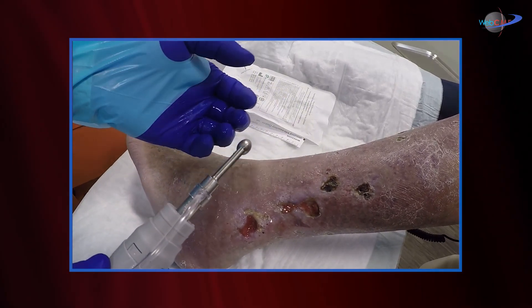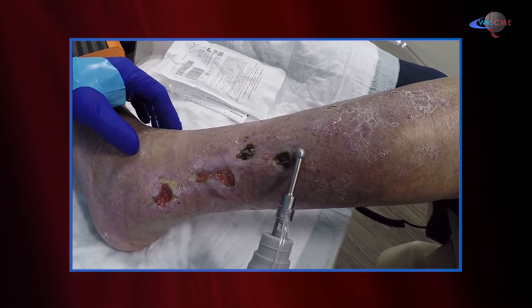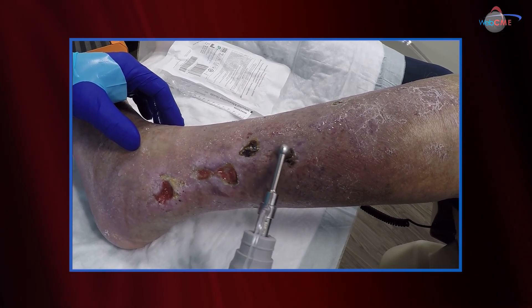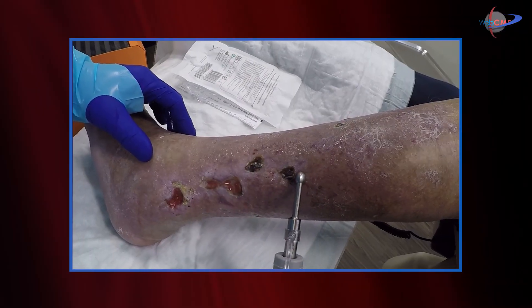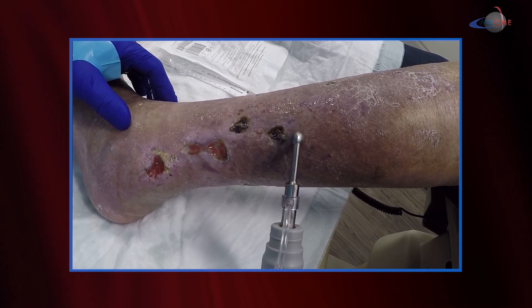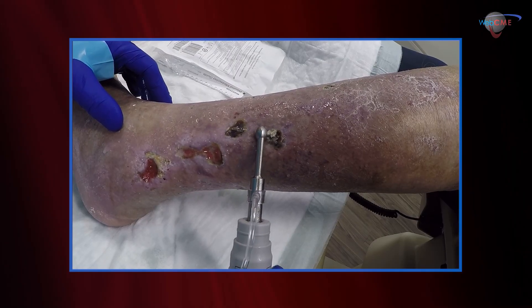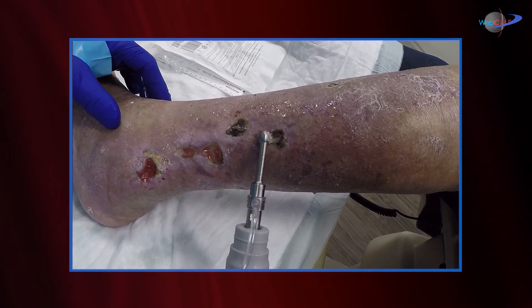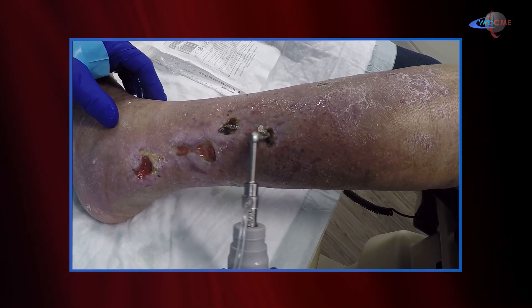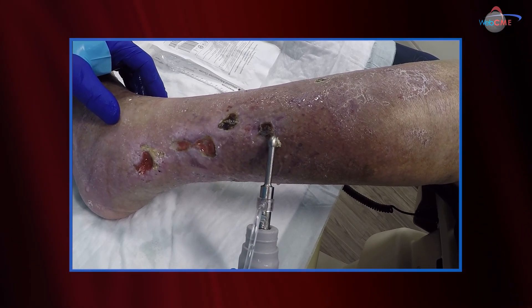The important principles with ultrasonic debridement is to sonicate the tissue. We don't just debride quickly — we move in slow, steady motions, and as you sonicate the tissue it will loosen. Once you've sonicated the tissue, you can then bring the probe over. This is a curette-shaped probe and you can slice right underneath that tissue. See — we're removing that eschar. This is a great device for debriding superficial eschar, as it just loosens the eschar.